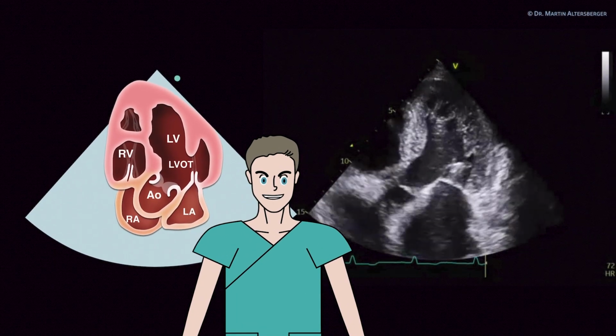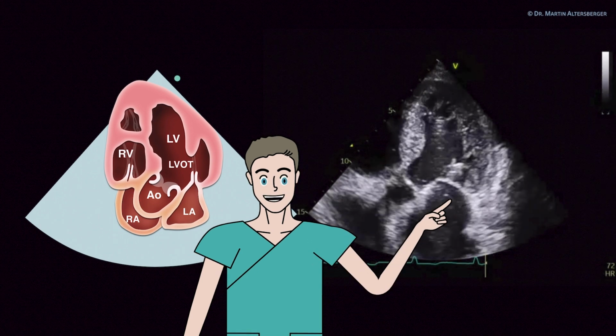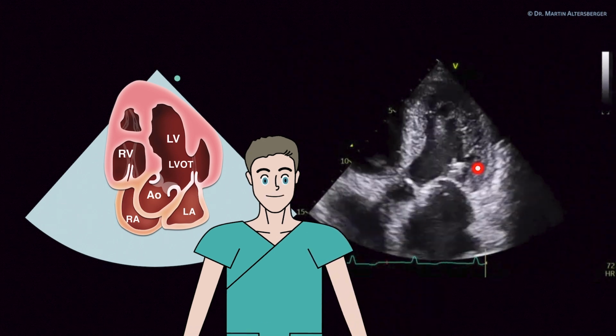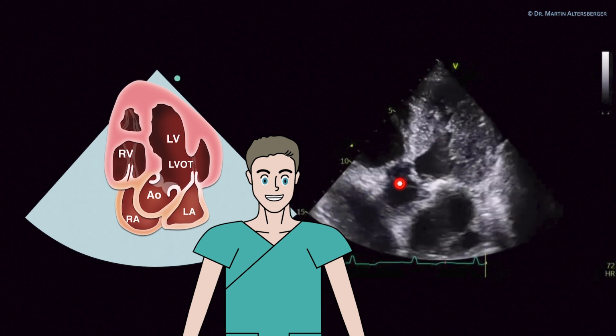How does it translate now in echocardiography? Here we have an echo image. Here we see the aortic valve as the 5th chamber. Some information of the right atrium, the left atrium and the right ventricle is lost, but still we can see in this patient with amyloid heart disease the severely thickened left ventricular walls, and here the LVOT and also the thickened aortic valve.